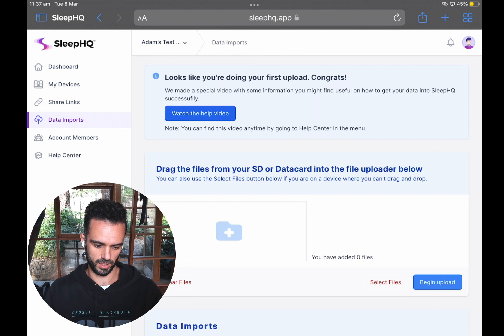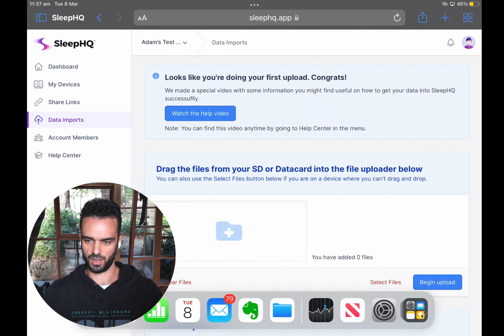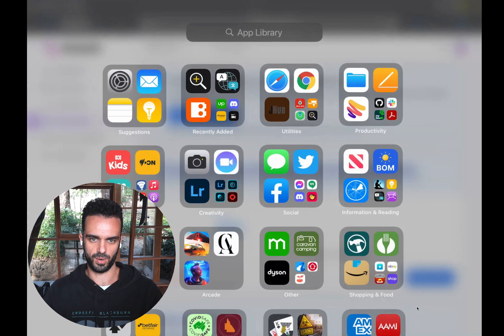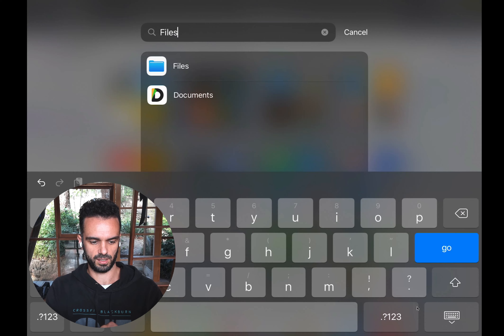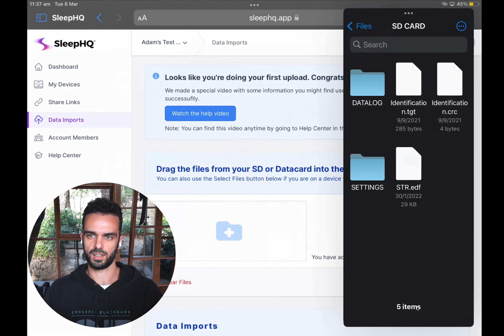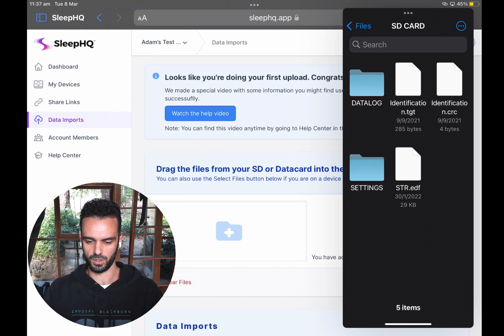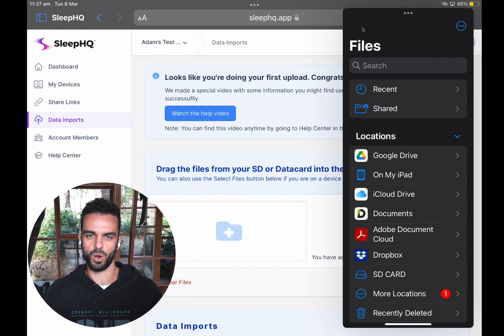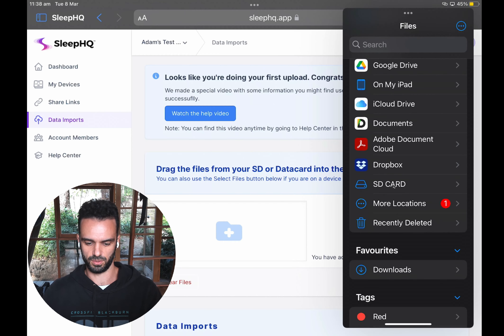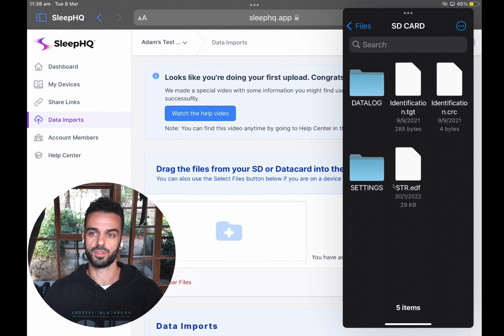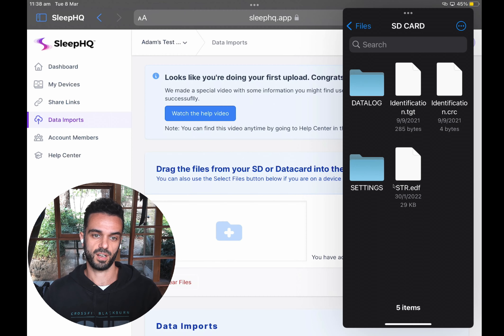To do that on an iPad, I'm going to swipe up from the bottom — you can see at the bottom I've got all my different apps. I'm going to click on that and in the app library search for Files. Once I've found the Files app, I'm going to click and drag it out to the side, which gives me a file browser over the top of my internet browser. Clicking the Files button at the top left takes me all the way back to the top level of the iPad, where I can see my SD card connected. I'll click on SD card and it shows me all the files from my CPAP machine.